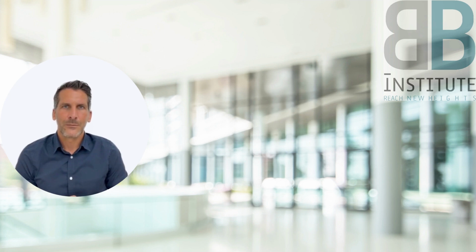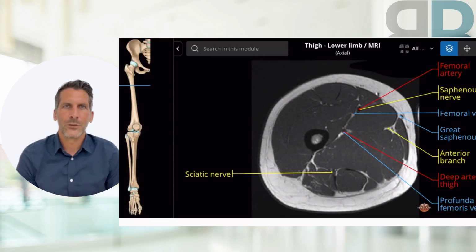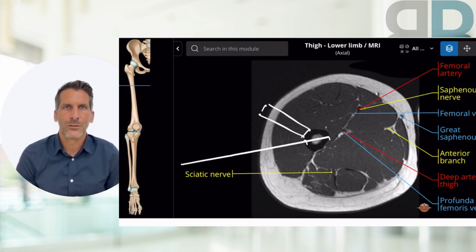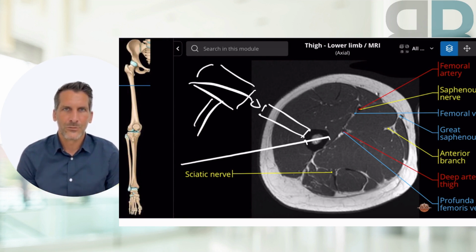Let's first discuss the most commonly performed external cut. For this, you need an approximately 30 cm long drill with which the bone is weakened in a fan shape and finally broken through with a chisel and a hammer. This method of bone cutting is the most common, as no special tools are needed, just a drill, a hammer, and a chisel. No special techniques are required for the cutting either.